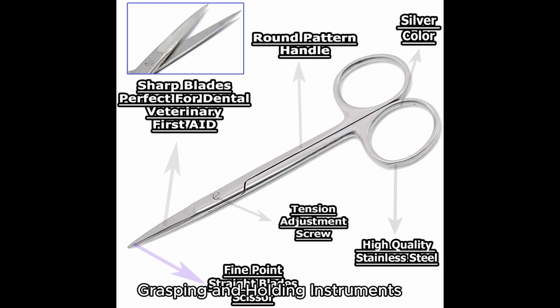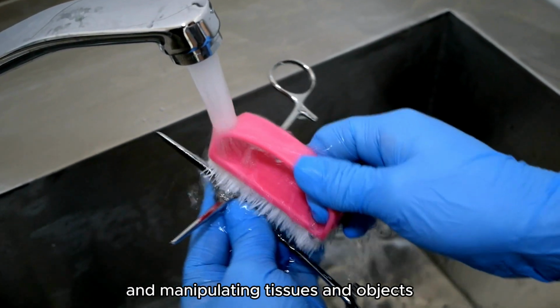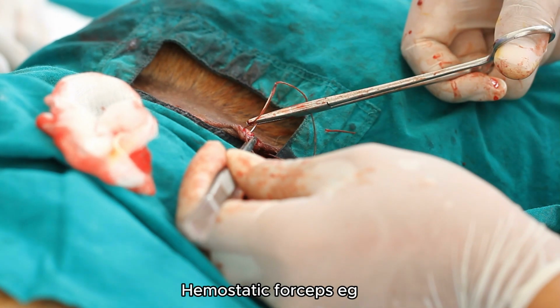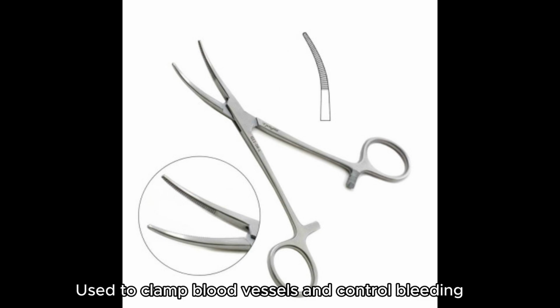Grasping and holding instruments. Forceps, used for grasping, holding, and manipulating tissues and objects. Thumb forceps, for example, Adson forceps, used to hold and stabilize tissues. Hemostatic forceps, for example, Kelly or mosquito forceps, used to clamp blood vessels and control bleeding.